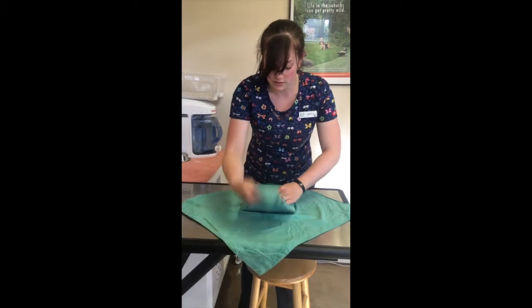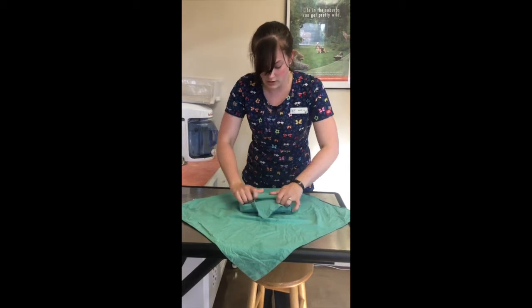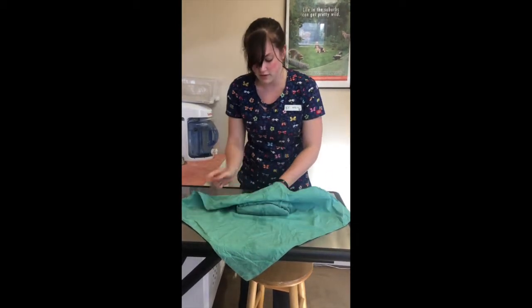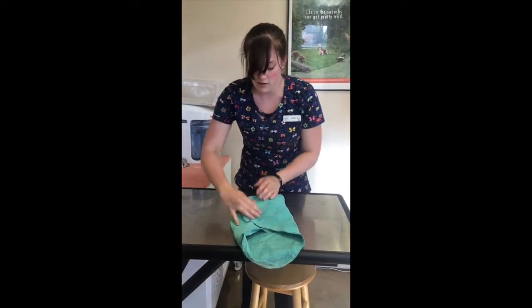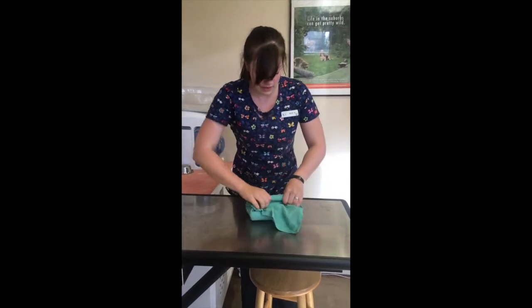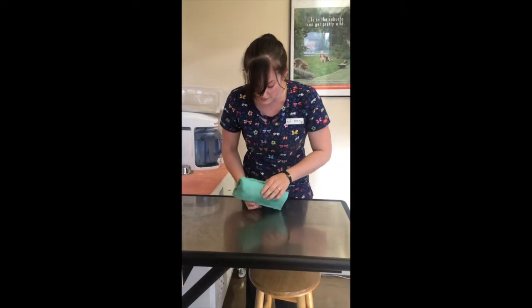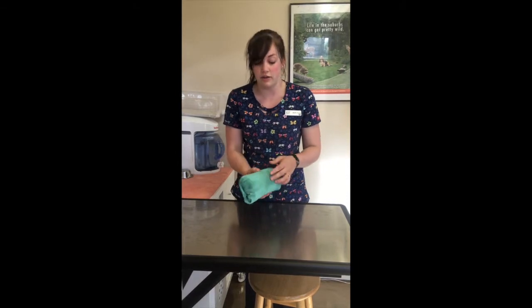Do that. Fold it. Alright, making sure that there's a tab to easily open it. Once that's done, I'm going to wrap the outer portion of the pack. Right. You want to make sure that there are no gaps in your pack, no holes, that it's all sealed nice and tight, so you can see that this is wrapped snugly. It's not too tight, it's going to get sterile all the way through.